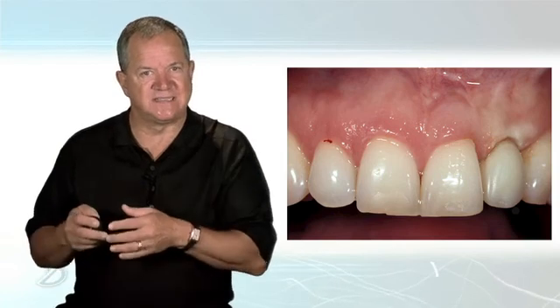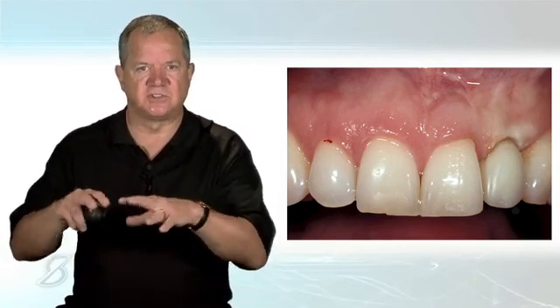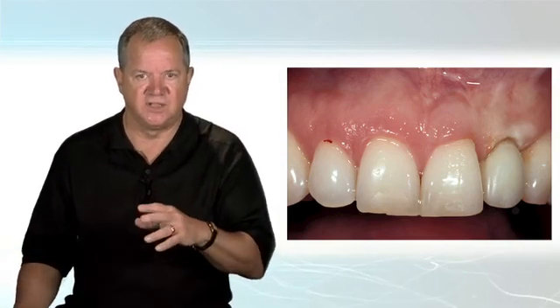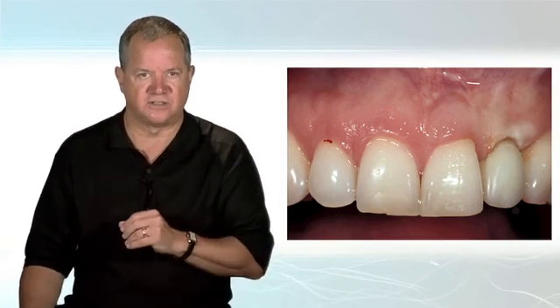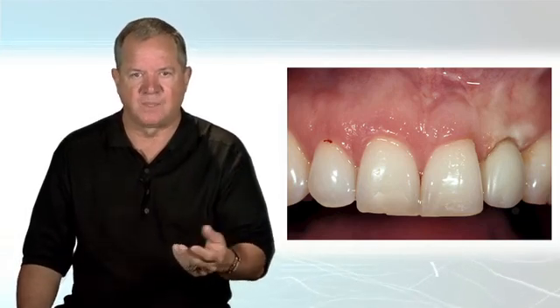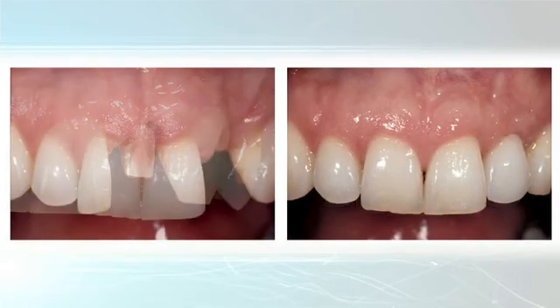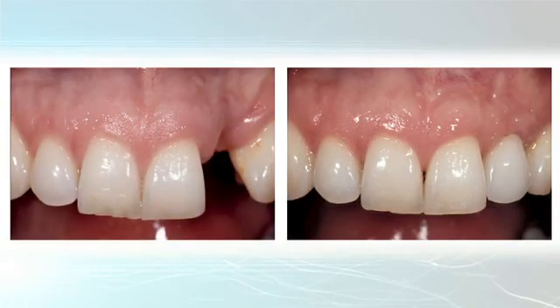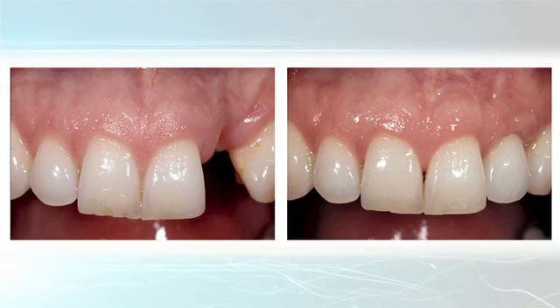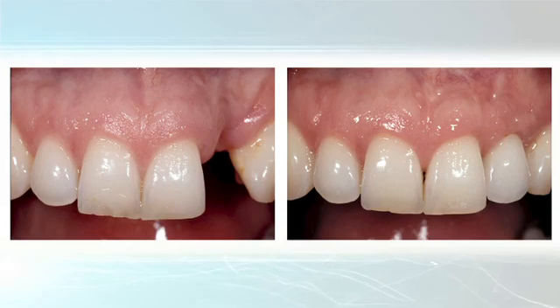But I wouldn't do this the day I seated the temporary typically. I would go at least 4 to 6 weeks to see what the tissue does around the temporary before I would actually start carving on the tissue. Now, once this is done, I would go another month of healing, then make your final impression, and then everything else proceeds the same as we talked. And you can see the left screen is where she started, and the right screen is what the final restoration looks like the day it was seated. The tissue profile really very closely mimicking the tissue profile of her natural right lateral incisor.